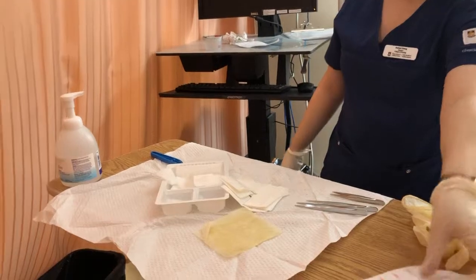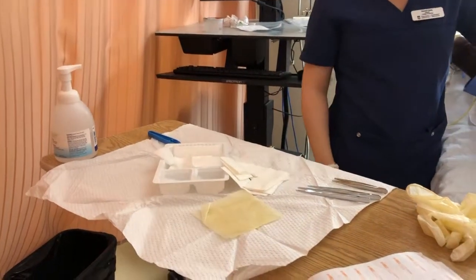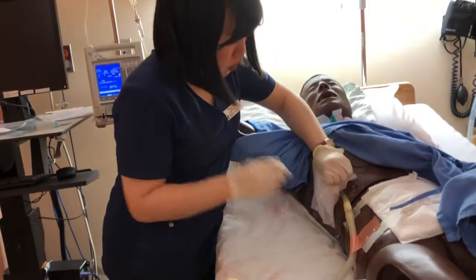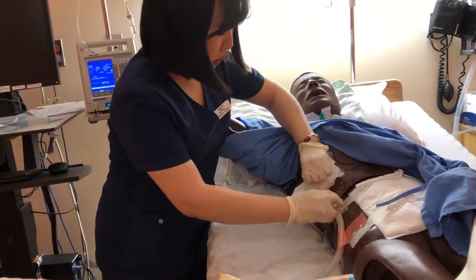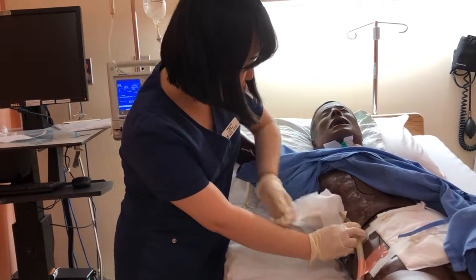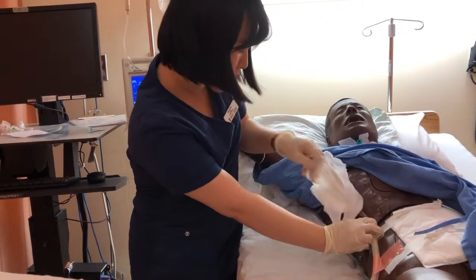I'm gonna place my Medifix on the chest tube, because normally it would be sutured in. I'm gonna take this old dressing out. The chest tube is stitched in there, and you have to be careful not to peel it off. The dressing is two IV gauze and one 4x4. I'm just gonna assess for any saturation or any abnormalities.